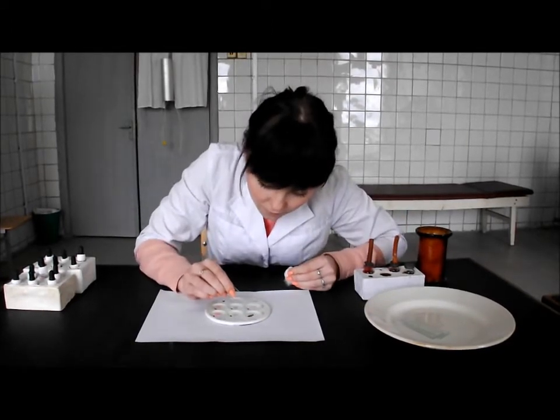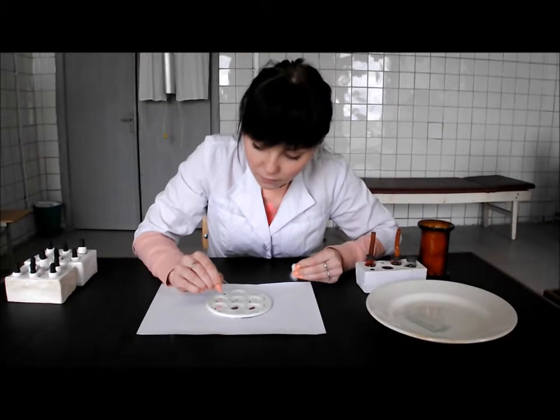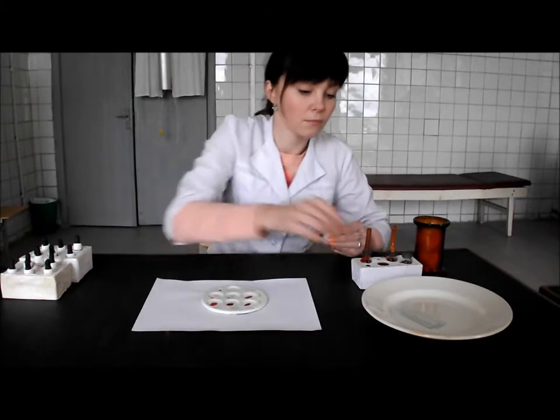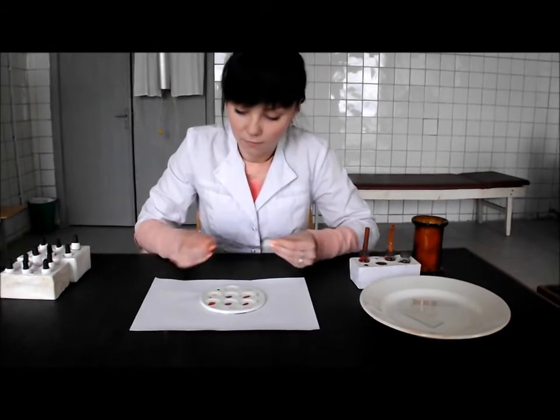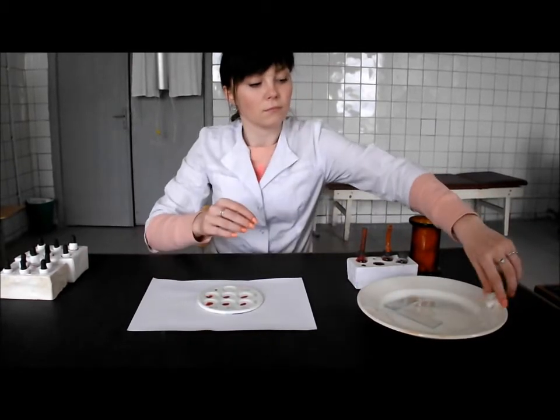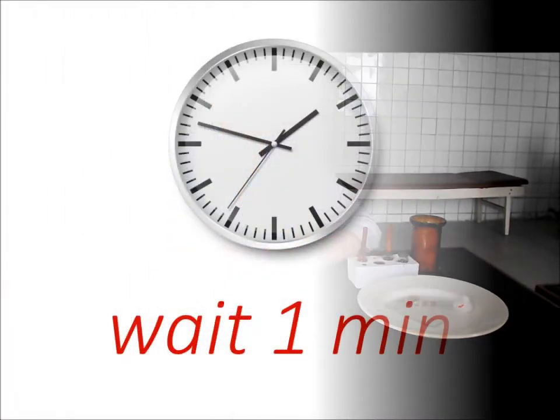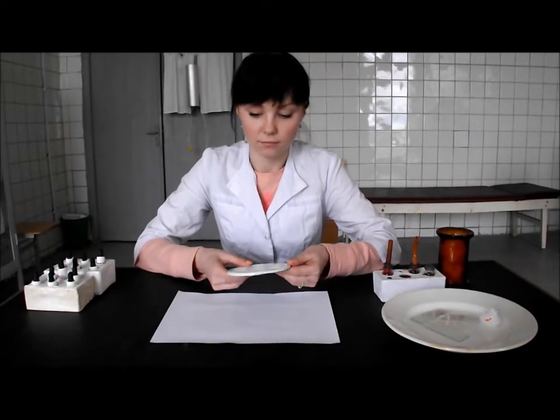Mix these drops of serum and blood with the help of different corners of the slide. Shake the dish. Put it on the table within 1 minute. After that, tilt the laboratory dish to and fro in various directions during 4 minutes.